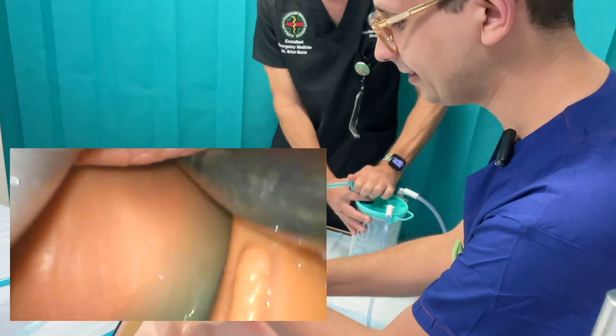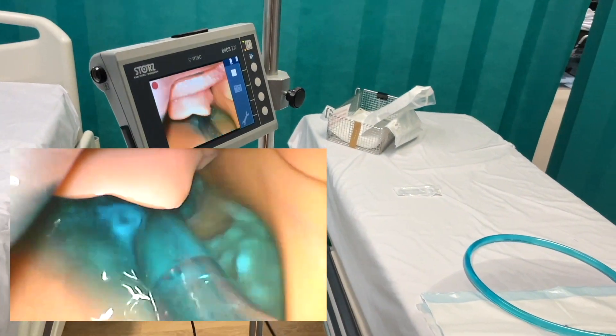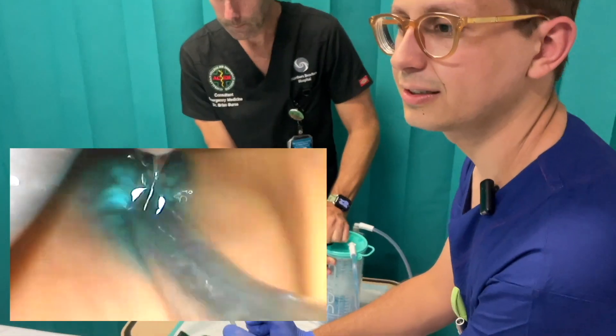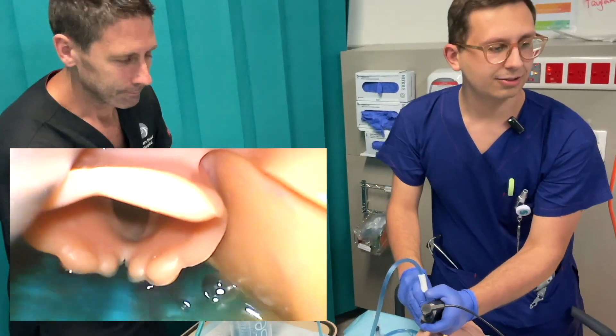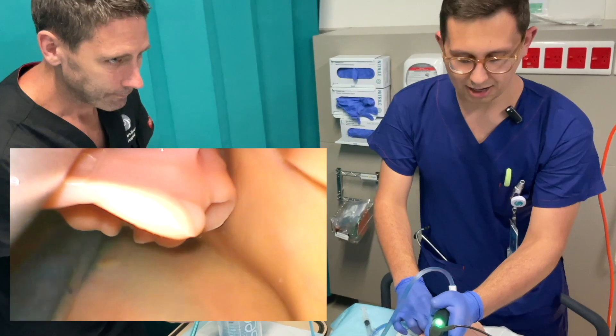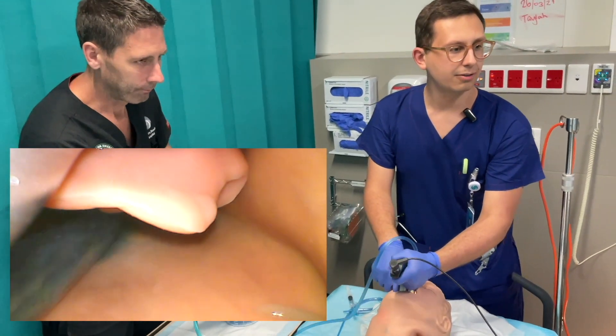I'll go in with the laryngoscope. What is really important is that I stay high and dry. So I'm identifying my structures. The epiglottis is down there. I have now the DuCanto in the esophagus and I put it now to the left side, so that I have space for intubating on the right side.